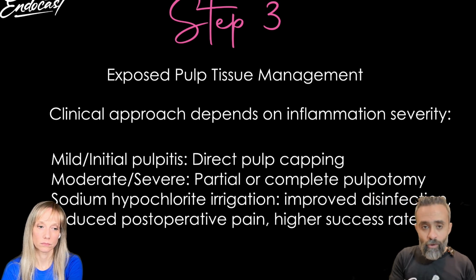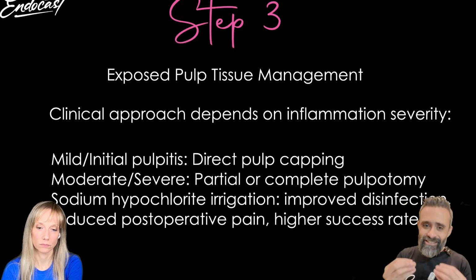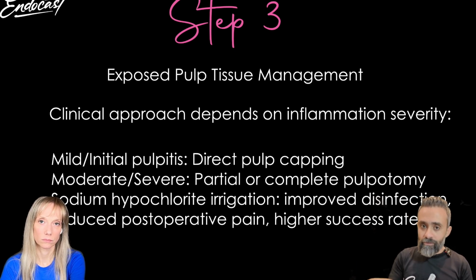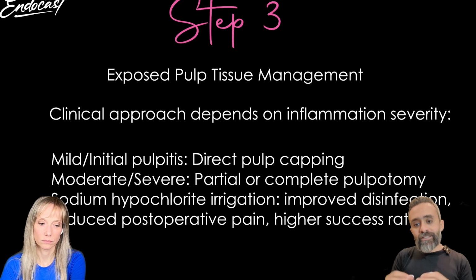So if you have exposure and this exposure is small, but it's still showing some bleeding that is not responsive to the usual hemostasis that we perform, like a cotton pellet with saline or a flush of sodium hypochlorite or a pellet soaked with low concentration sodium hypochlorite, and there's still some sort of minute bleeding coming from that exposure.